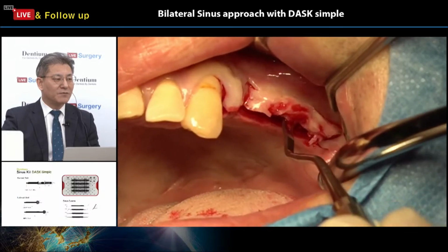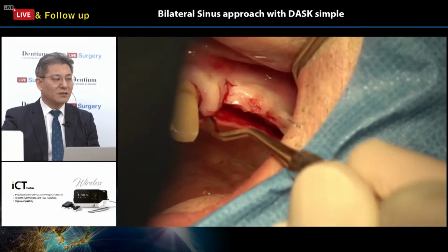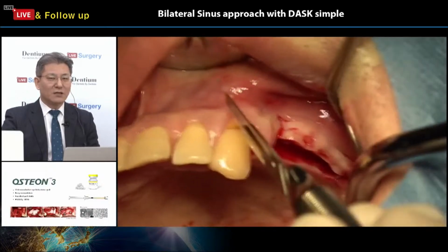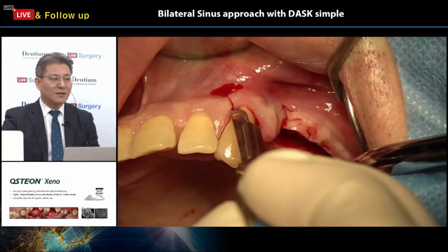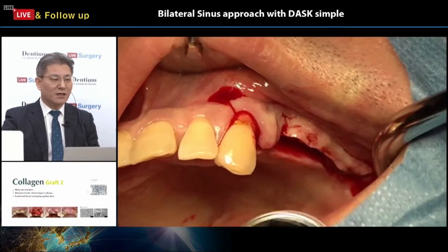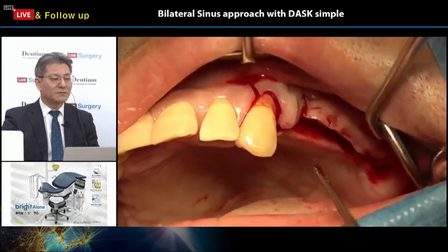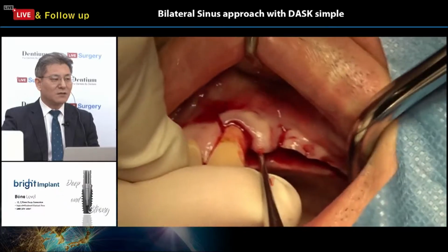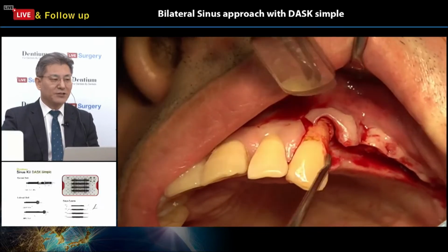Okay, the flap reflection procedure now uses the back action chisel. There are many useful instruments for flap reflection. The small round curette is also available, and the Ochsenbein chisel like this, the back action chisel, and the small round periosteal curettes are applied for a full thickness flap reflection.